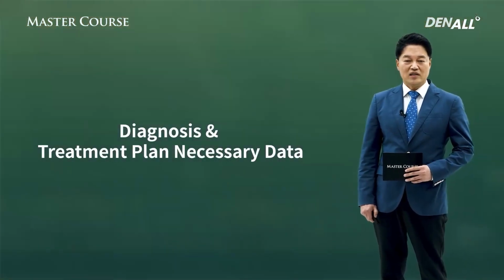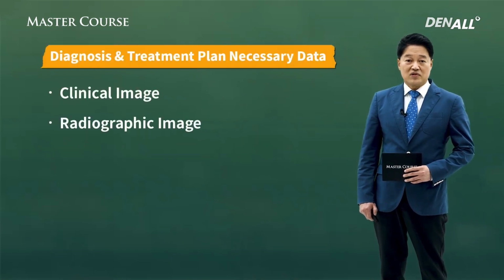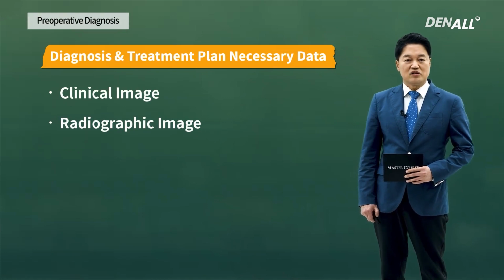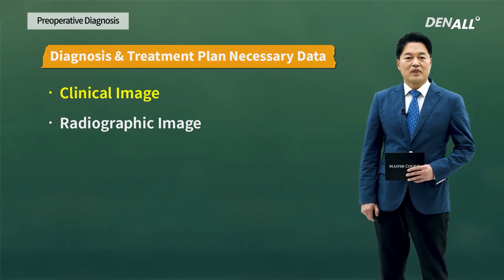Second, diagnosis and necessary data for treatment plans. As mentioned, there's clinical image and radiographic image. I'm going to look at clinical image first.